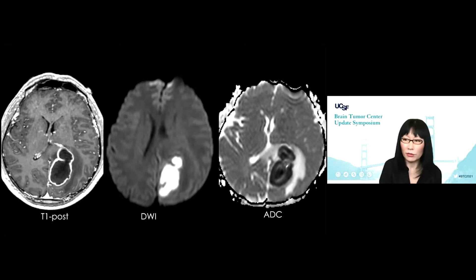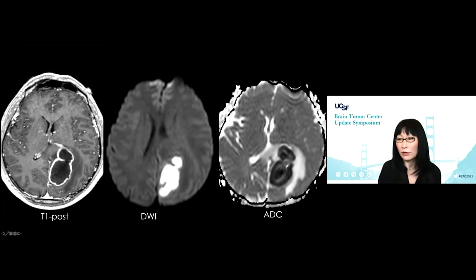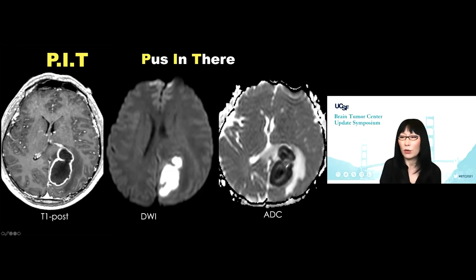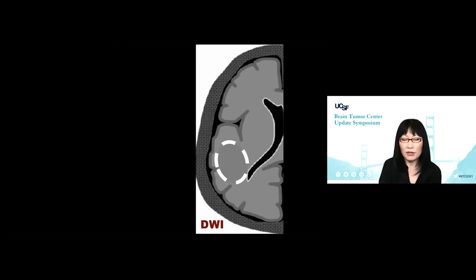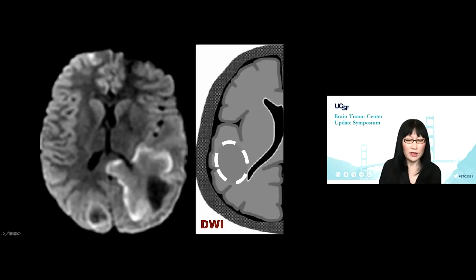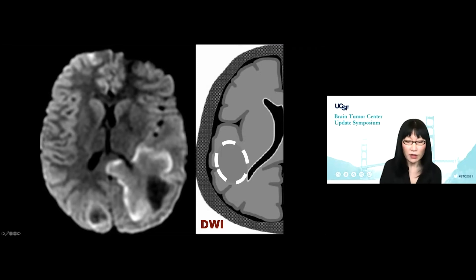Another patient came to our institution from outside with a diagnosis of left parietal glioblastoma. Once you see DWI and ADC, this is not glioblastoma — this is what I call PIT plus. How about this pattern? Very different from that abscess — there's a leading edge of reduced diffusion, and there are second lesions here too. This was thought to be lymphoma, but this is not compatible with lymphoma in terms of diffusion.